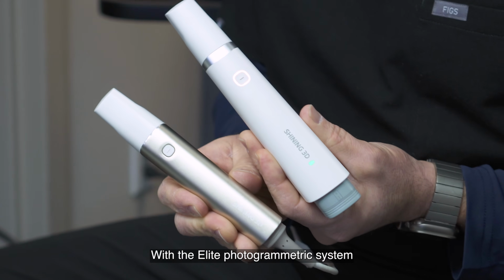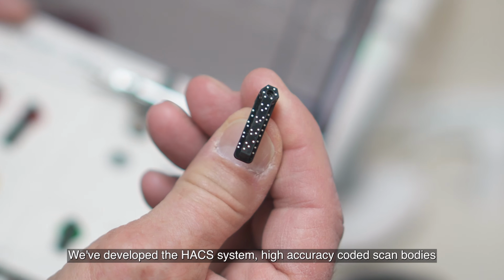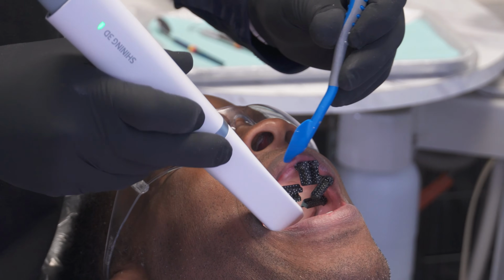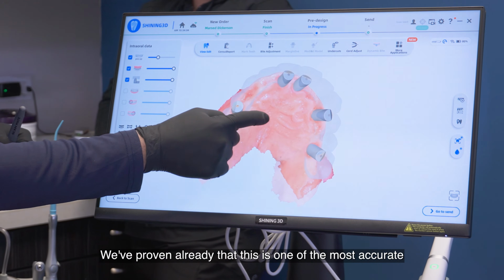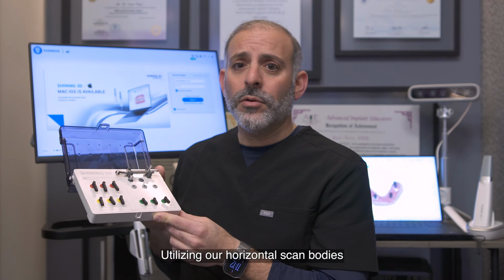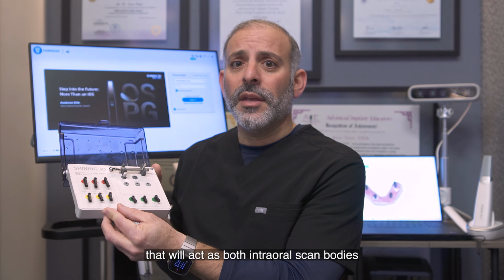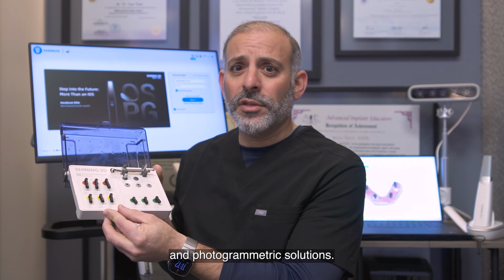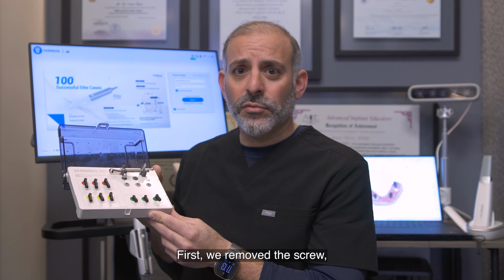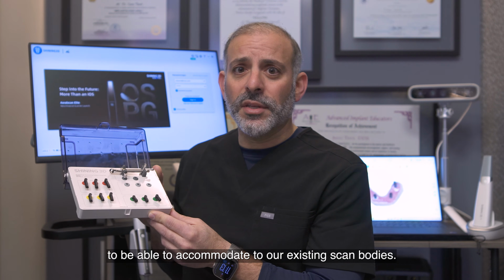With the Elite Intraoral Photogrammetric system, we've developed the HACS system, High Accuracy Coded Scanbodies, to be used for intraoral photogrammetric implant capture. We've proven already that this is one of the most accurate ways to capture implant positions. Utilizing our horizontal scan bodies that act as both intraoral scan bodies and photogrammetric solutions, we've taken it a step further. First, we've removed the screw, making it easier for other systems to accommodate our existing scan bodies.